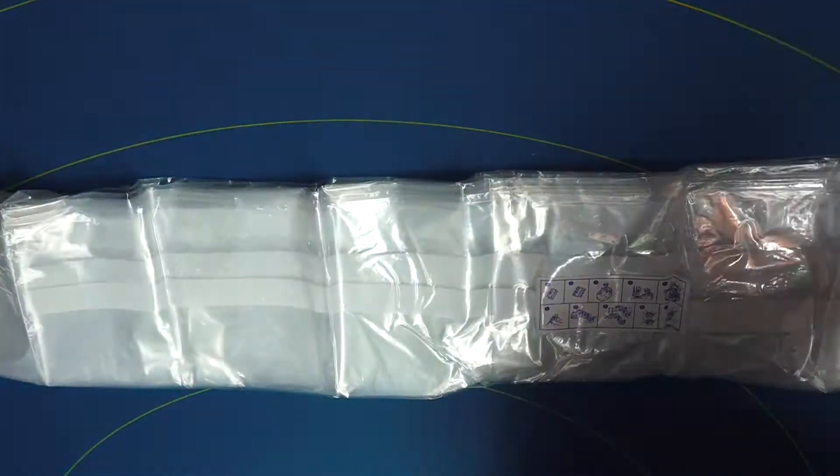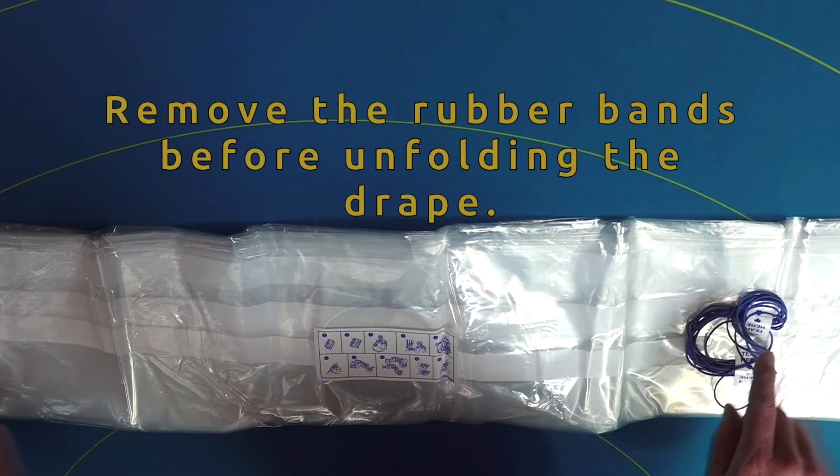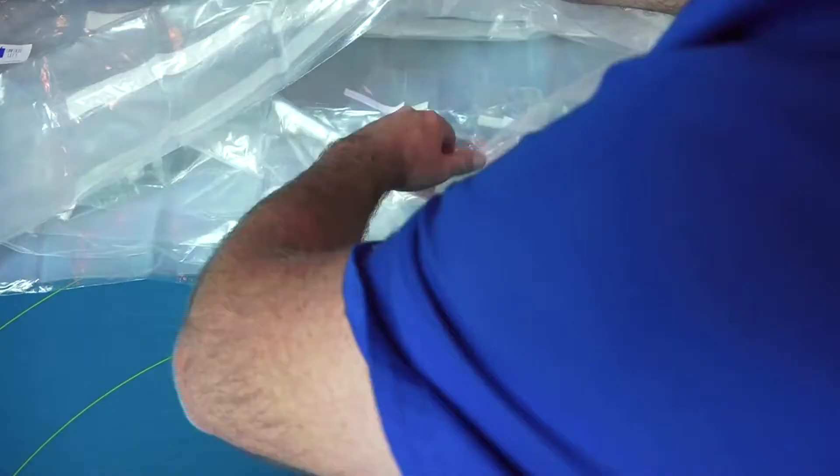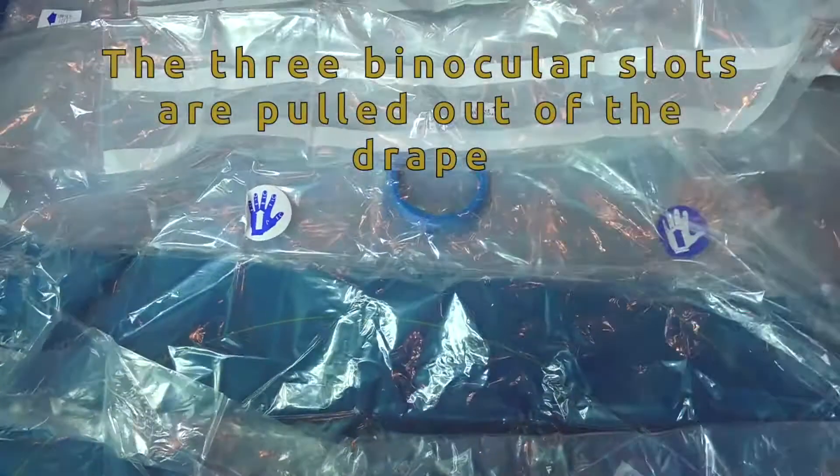At the beginning of the draping process, the directions included on the drape will indicate that the binocular slot should be pulled out immediately after unfolding the drape. This step is imperative for correct positioning.